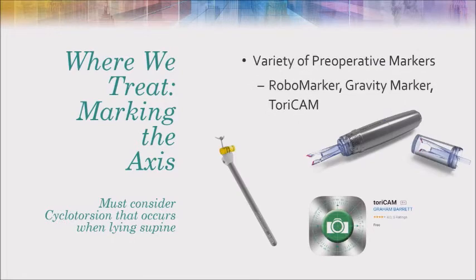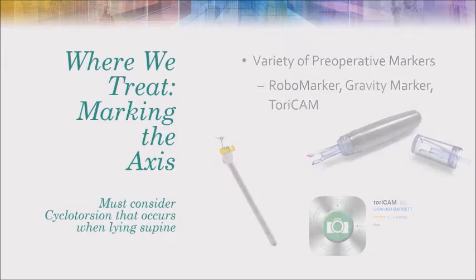So there are many ways that we can mark the axis in the pre-op area. There's a robo marker, a gravity marker. We've seen all these different things, and they're out there. And if that's all we have, that's the best we can do, because we can't go into the operating room not having clearly that axis marked.